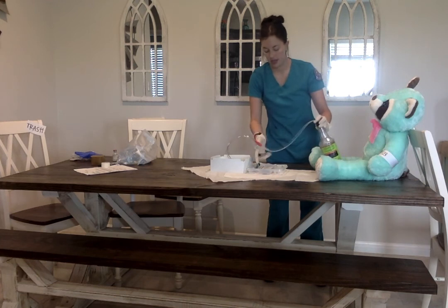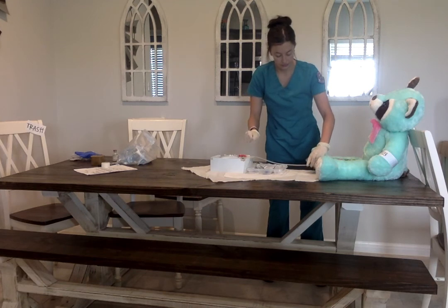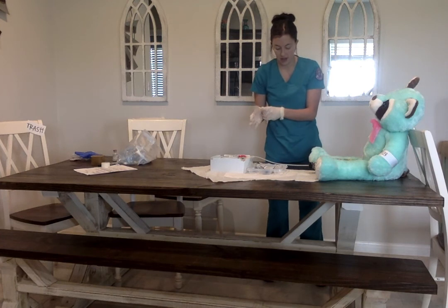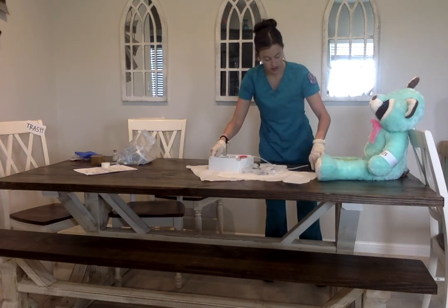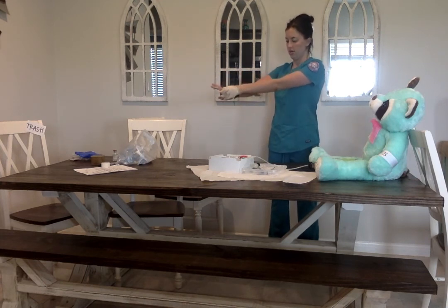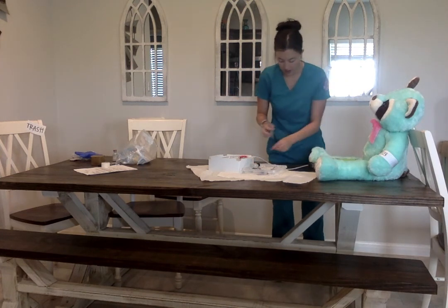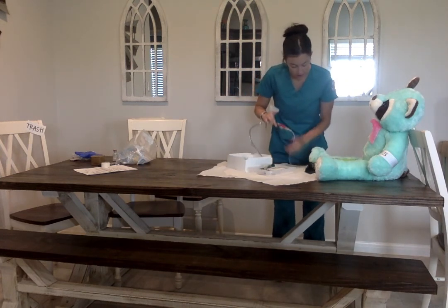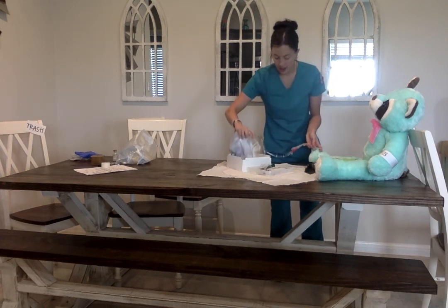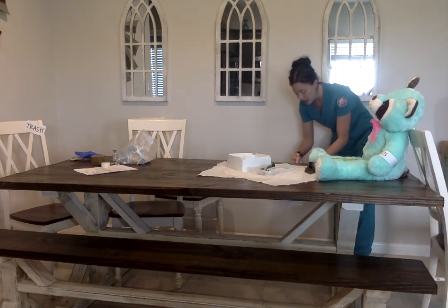Alright, easy as that. I'm going to lay you back down. I'm going to remove my gloves now. Put that in the trash. I'm going to tape this to the side of your leg, just in case, and I'm going to hang this not on the bed rail, but on the bed.